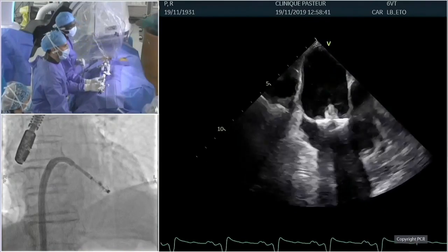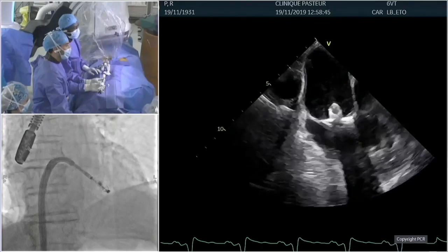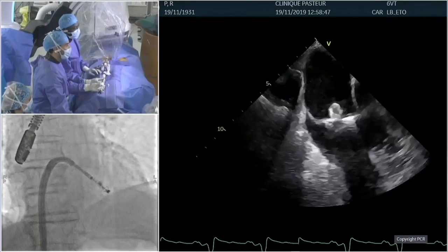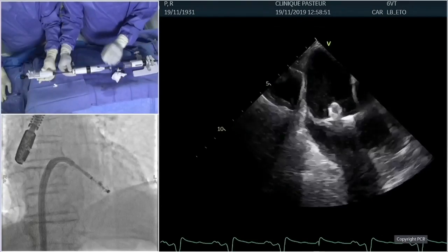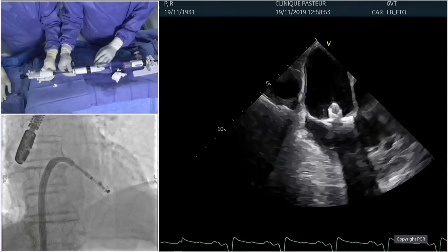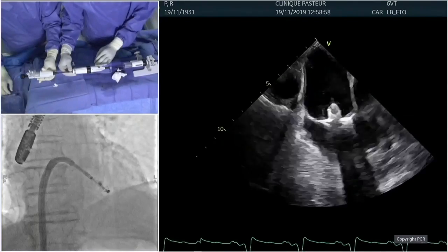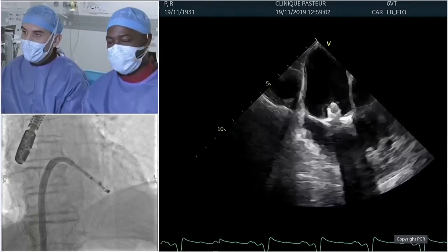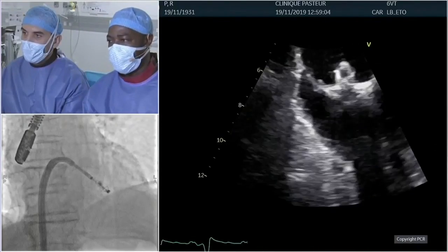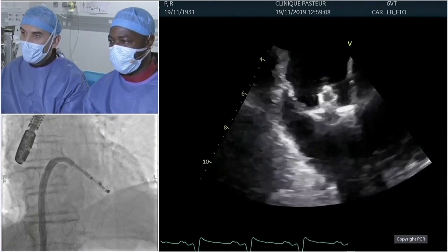Yeah, exactly. Okay. So we see, Didier, that we are located now at the place where we have the ruptured chordae. Yeah, exactly. We see the chordae going back and forth. We see the anterior leaflet opposed to the anterior clasp, anterior paddle, and dancing on that. Zoom. And we see the posterior leaflet also on the paddle with a ruptured chordae.